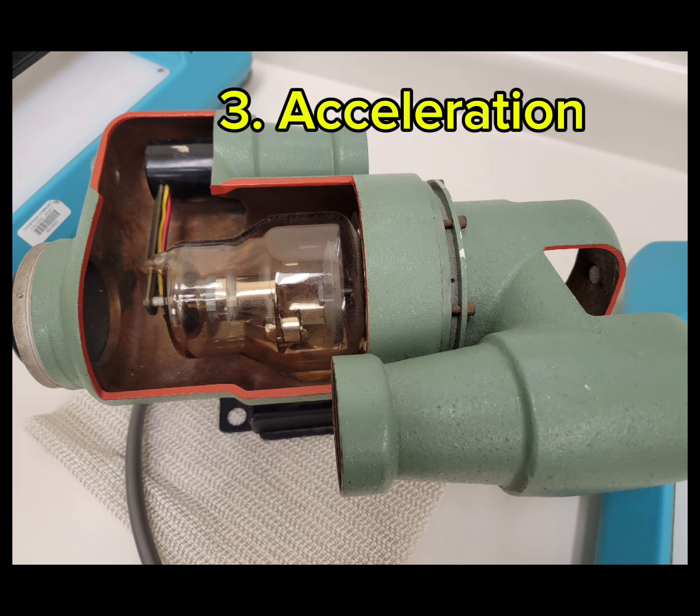Also, can I just take a second to say how cool it is that somehow we were able to cut a hole through the metal housing of an X-ray tube and expose the glass envelope inside without breaking it?